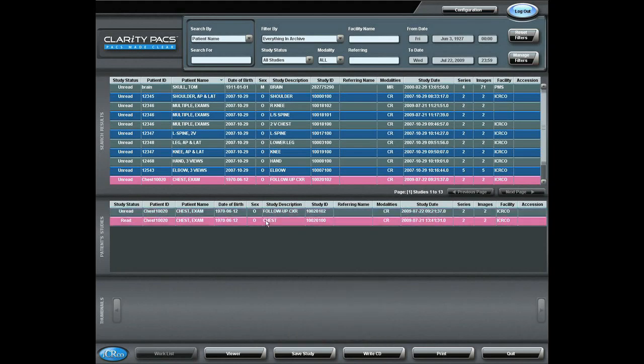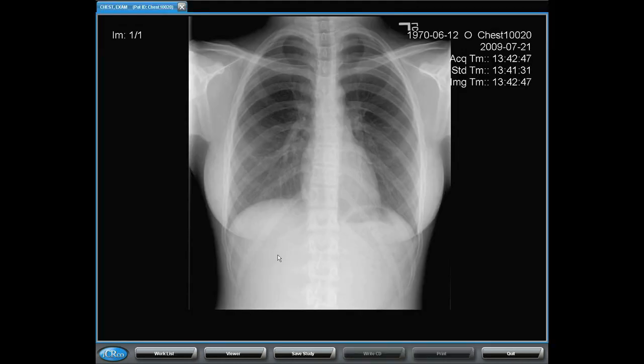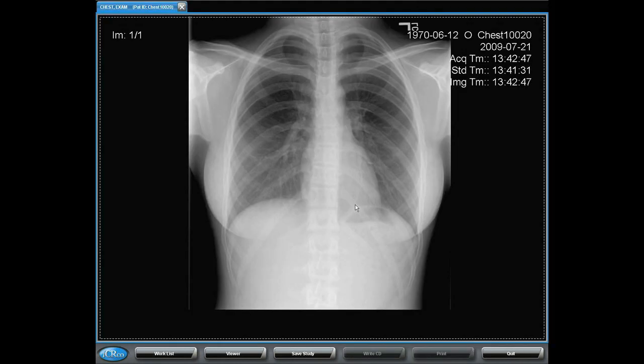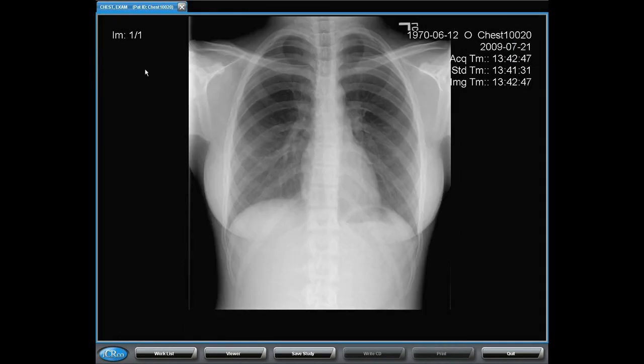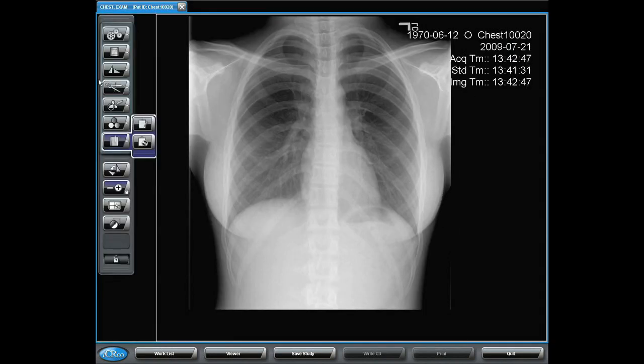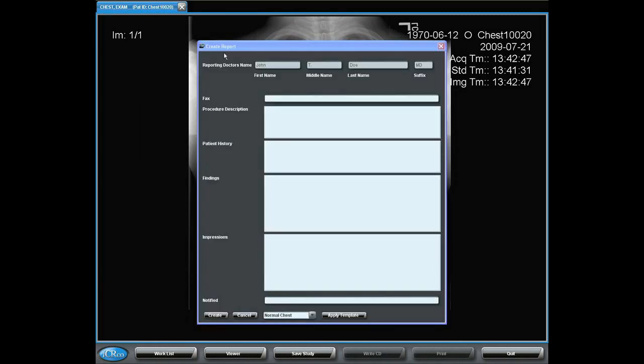So, when I access the examination that I'm going to interpret, I read my PA and my lateral views. I can access from my toolbar the report function.